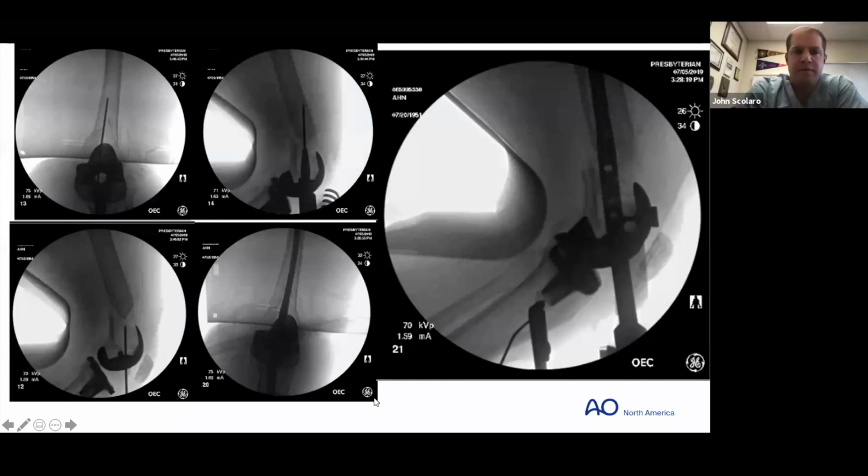Yeah, something in the posterior aspect of the proximal segment to drive the shaft down posteriorly and then replace the nail. I like the technique that Matt talked about. Utilize a stiff wire first, and see what it does. And then if you like what it does, then you can always replace it with a screw. But instead of making a bunch of 5 millimeter Swiss cheese holes around the femur, I think at a minimum a 2.4 millimeter or 2.8 millimeter Kirschner wire can be strong enough to affect change. Great.